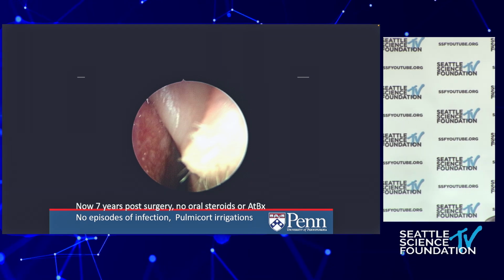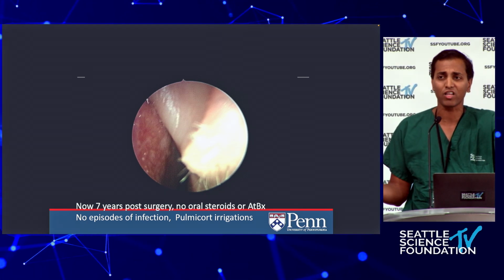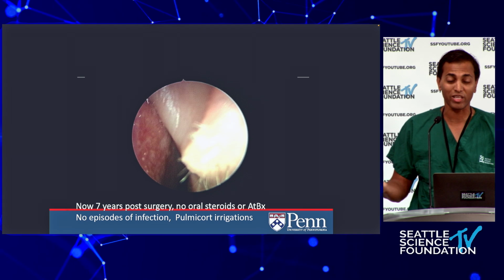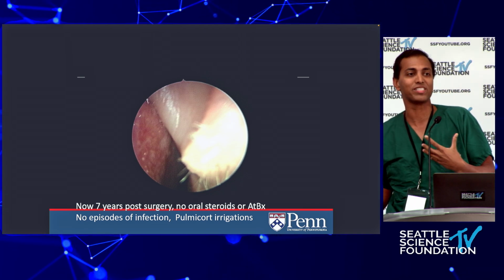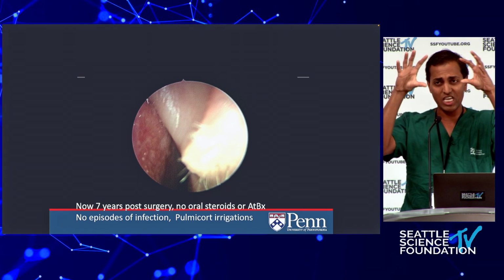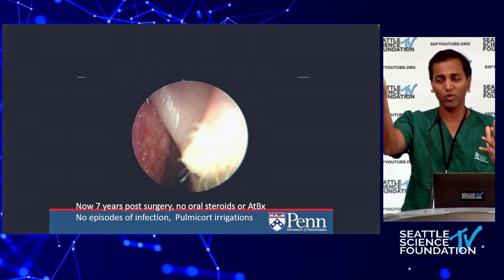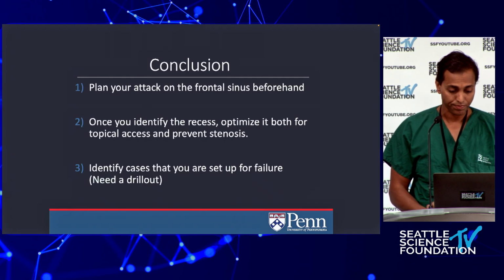So here I had to open them up much more aggressively with the drill. Now, going back to a point brought up before, which I think is valid, is if we get into these cells on a number of patients, how many patients do well versus do poorly? That we really don't know the answer to. Like I said, I'm biased on the side that I'm seeing the ones that get to me as well. But for me, when I see a lot of those cells and I see inflammation around the cell, so it's not just obstructive, those are the ones I am more aggressive with, because I think just aerating those cells is not enough for me. I really need to get in there and open those up.